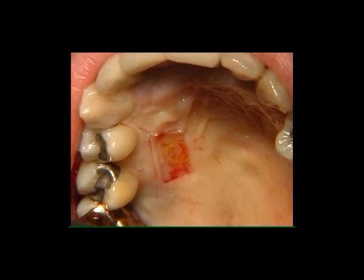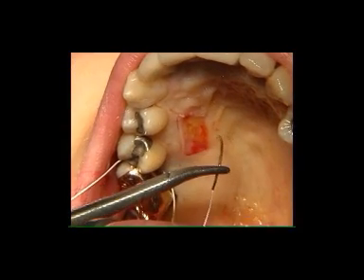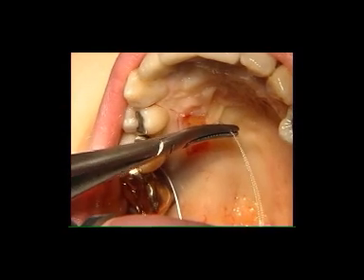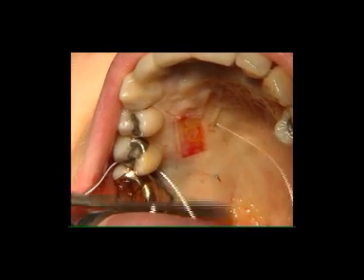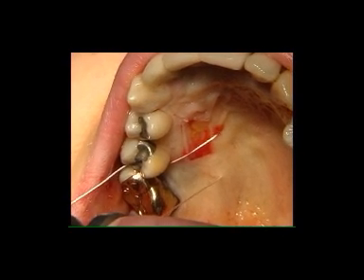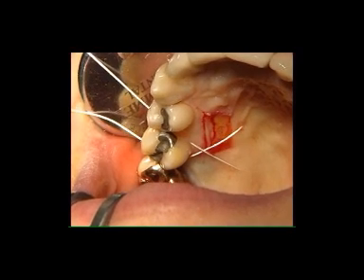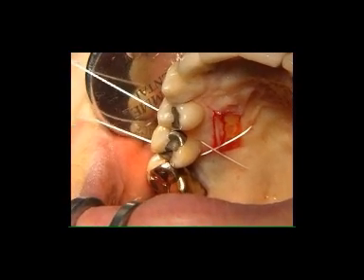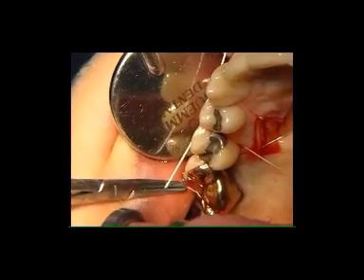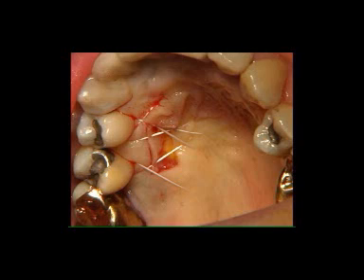Once the interdental contact between the 1st molar and 2nd premolar has been passed, by means of a horizontal mattress stitch, the palatine tissue is penetrated apically to the donor site area in a mesial distal direction, therefore passing the interdental contact between the premolars, returning vestibularly, and a surgical knot is made on the vestibular aspect. Once the suture has been completed, surgical dressing is positioned in order to protect the wound.